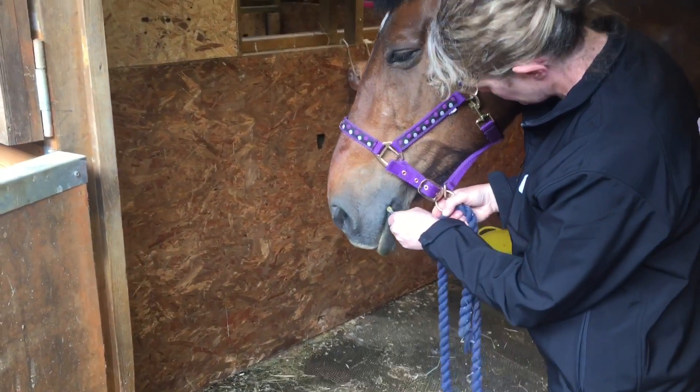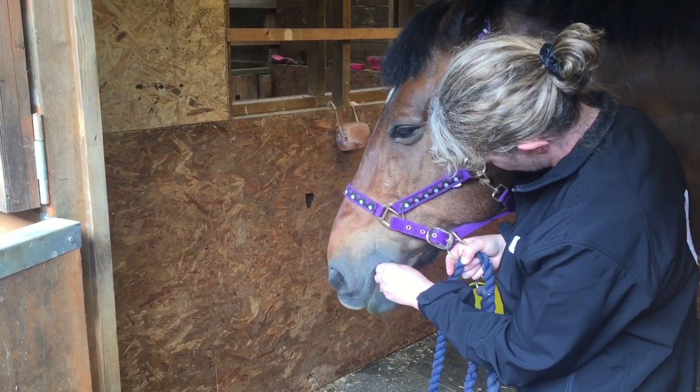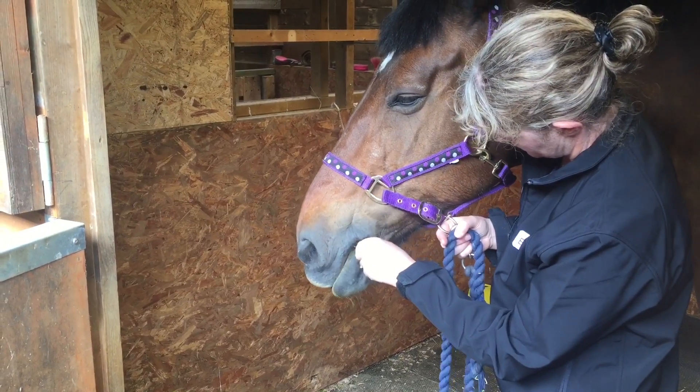If the horse does manage to bite the swab, don't pull hard on the swab and panic, but instead hold the swab firmly and remove it. In most cases it is fine to continue using the swab to sample.